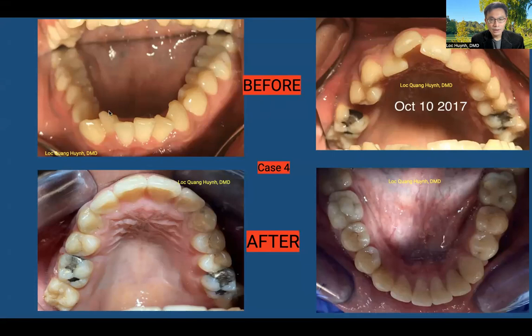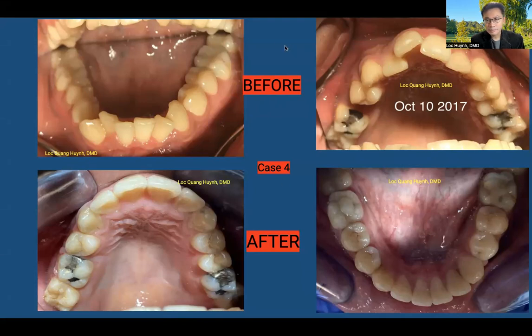Number 26 is lingually inclined. Number 23 is lingually and mesially inclined, and distally facially rotated. Numbers 24 and 25 are out of alignment. Rotation of numbers 22 and 27 as well. On the top, you can see teeth 8 and 9 are crooked. Number 7 is lingually inclined, number 10 is lingually inclined, and number 13 is missing.